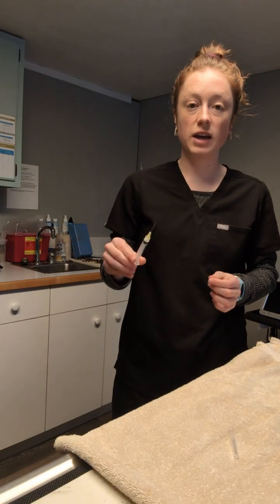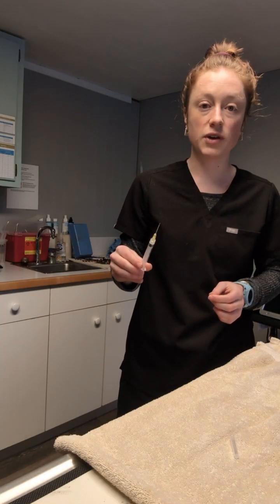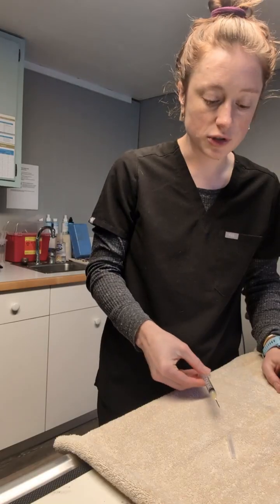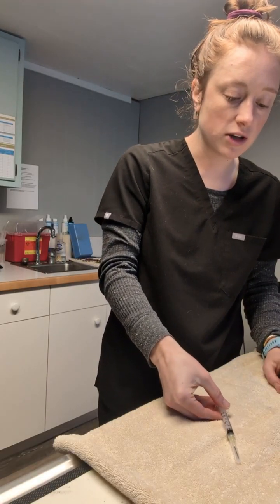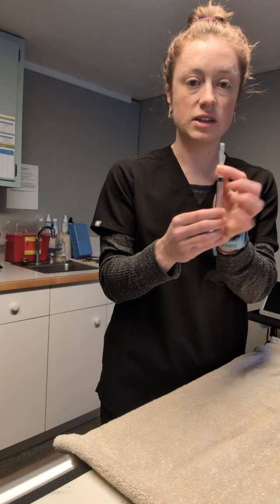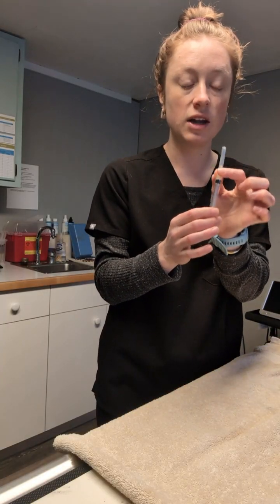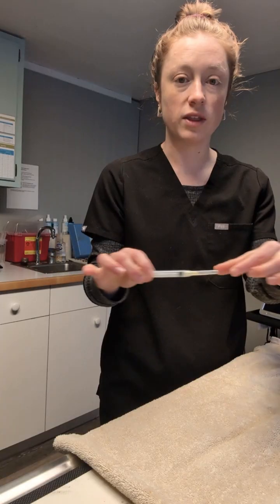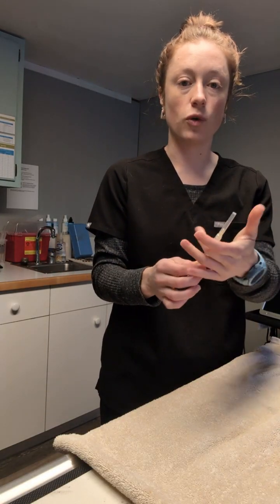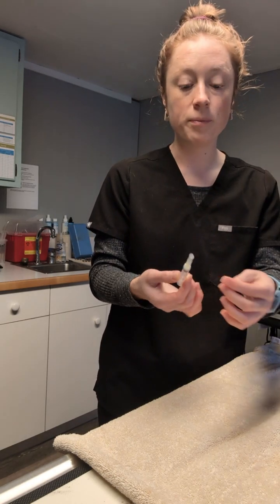So after using a syringe, I want to make sure that I'm disposing of it properly. So usually the cap is on the table, so I just want to load it back onto the cap, and then I can secure it, reseat it into the cap just on the outside. I don't want to ever be poking the needle towards myself, holding the cap like this, or pushing it down with my thumb.